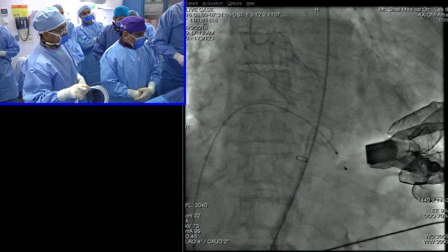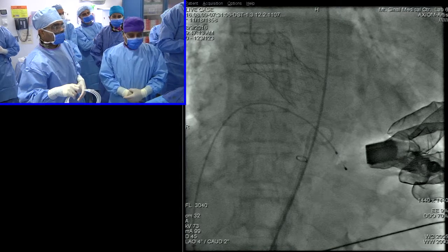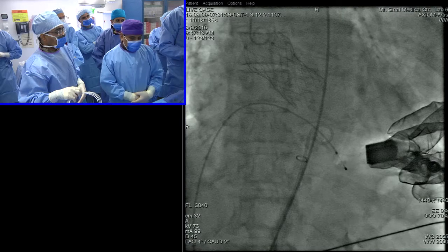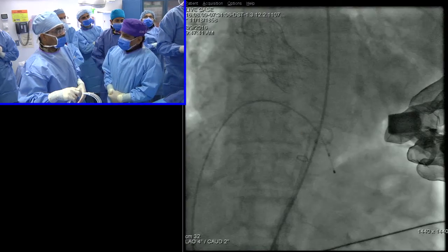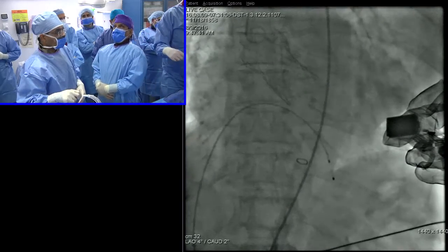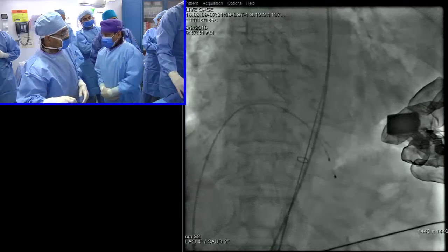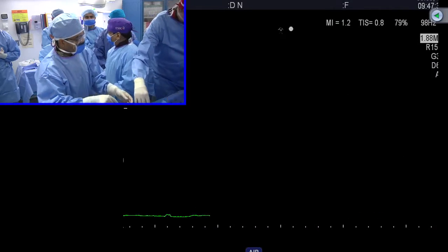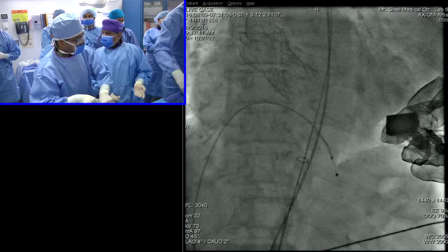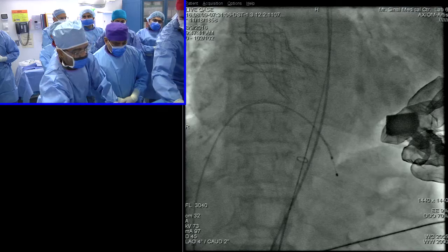The question always comes: what is the chance of conversion to open heart surgery during your TAVR? As you saw in the intermediate risk group, that number is 0.3%. If we take our own data, the last 300 to 400 cases, none. No case required open heart surgery. What could happen is pericardial effusion from some perforation, which you aspirate, so pericardiocentesis is done sometimes.